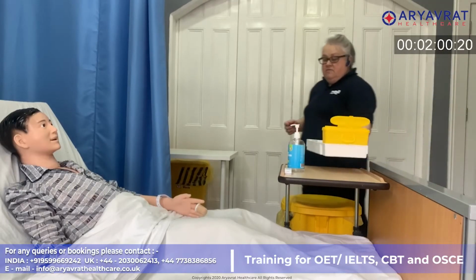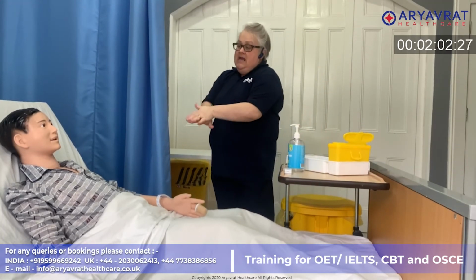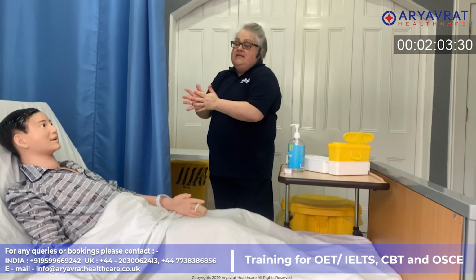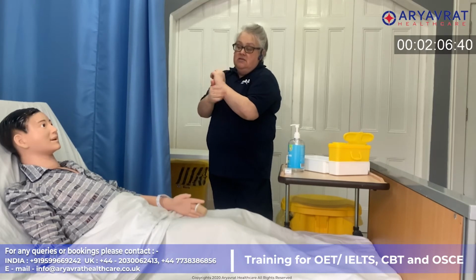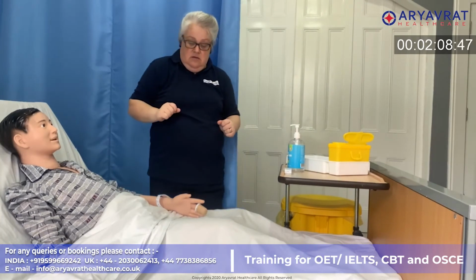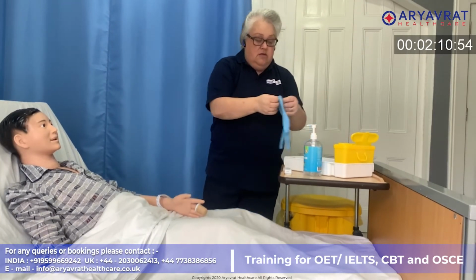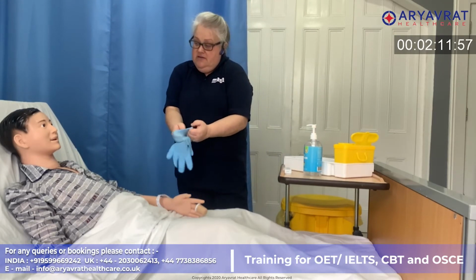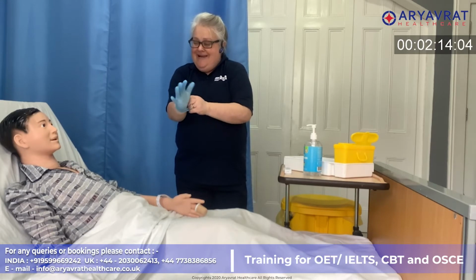Okay, just entering the room, checking for safety one more time, doing my hand hygiene. Hi Ali, I'm back. Hello. Did you manage to wash your hand okay? Yes. Okay, lovely. Do you have any preference on which finger we would like to use? No, but it would be good if you can use my left hand, please. Okay. Do you normally do this yourself? I have done it. Okay. So you can watch, make sure I'm doing it correctly, okay?